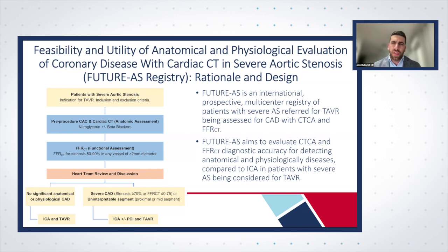But as we're moving towards younger patients, where the lifetime risk for developing significant coronary artery disease is higher, and where the implications of baseline coronary artery disease for valve choice and the ability to recannulate the coronary arteries are important, characterizing that coronary artery disease is increasingly becoming relevant. And so one of the biggest limitations for the TAVR CT has been this reluctance to optimize the image quality. Right now, you wouldn't do a cardiac CT without optimizing it, with GTN to dilate the arteries or giving beta blockers to slow down the heart rate to avoid motion artifact and to give you image quality that would allow you to assess the stenosis and the presence and the burden of coronary atherosclerosis.